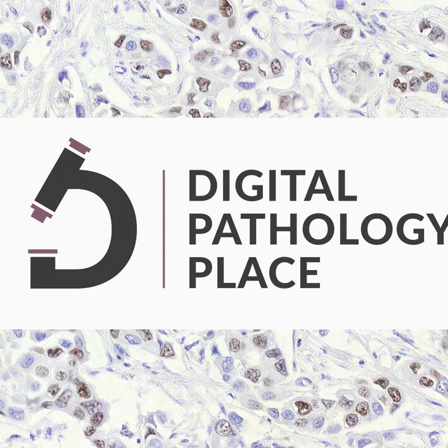investment in infrastructure. And you mentioned that when you're going to be working on an AI-based companion diagnostic, it's going to be a system. You said scanner, and the lab work for IHC, and it becomes an end-to-end workflow, right? Definitely. It's not just like IHC and you show it to a pathologist.